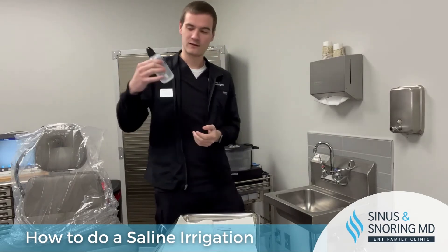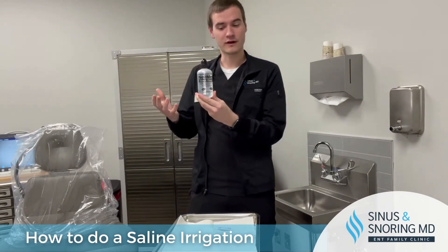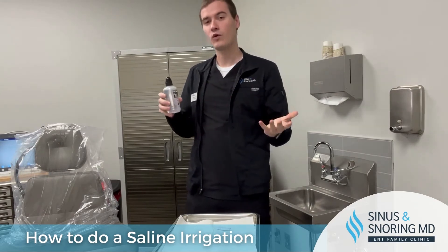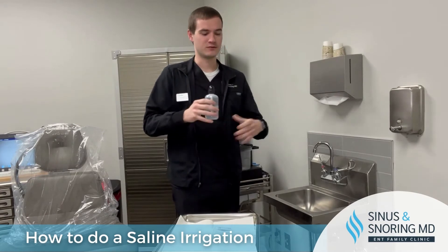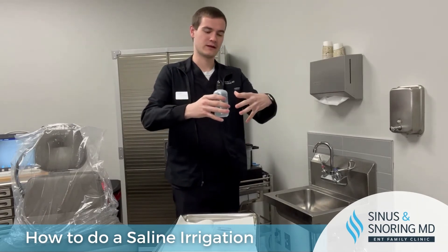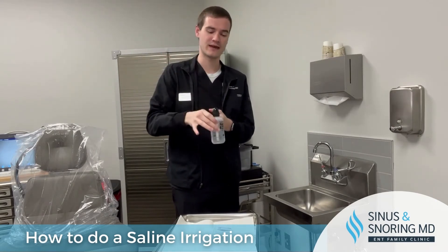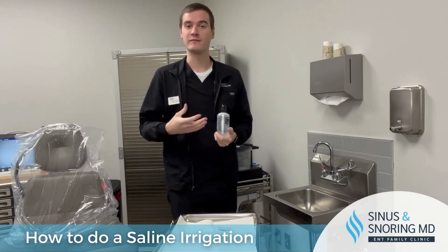For this bottle specifically, what you do is take bottled or distilled water and fill it up to the dotted line. You can warm the water — the best way to do it is to heat up a reservoir of water and submerge a filled NealMed sinus rinse bottle in that to gently warm it up. Some people feel that warming the sinus rinse prior makes it more comfortable.